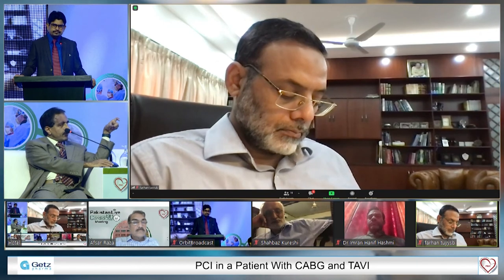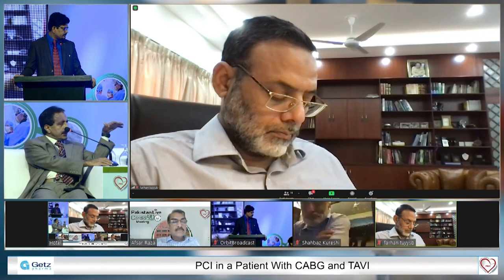TAVI aid software, a program which you can load on your phone also. There's also a recent JACC review which shows very clearly how to engage these arteries. But most of the time, like they were saying also, if you use a smaller catheter, like JL3.5 instead of JL4, and right, most of the time you are able to engage it.